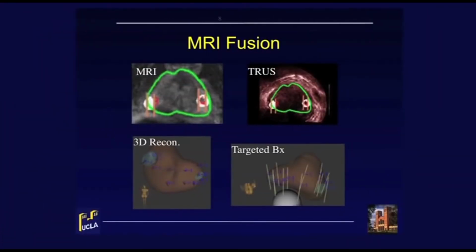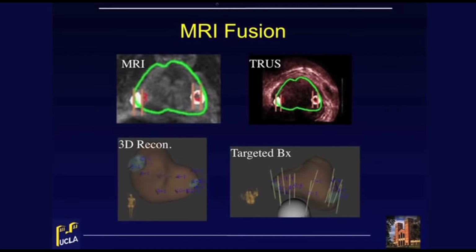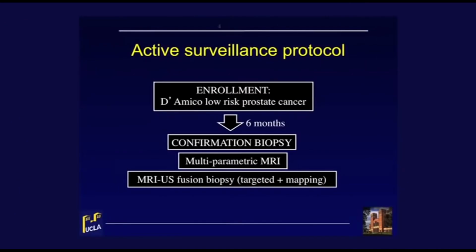A traditional active surveillance protocol includes periodic PSA, digital rectal examination, and TRUS biopsy. At UCLA, we've introduced two key elements to this scheme: multiparametric MRI and targeted biopsy. Patients with low-risk disease who are enrolled in active surveillance undergo multiparametric MRI and confirmation biopsy within 6 months. Both systematic mapping biopsies and targeted biopsies of any suspicious lesions are performed. A second biopsy is performed 12 months later. Since biopsy trajectories are electronically tracked, we are able to retarget prior positive sites. If no progression is observed, biopsy is then repeated every 2 years.